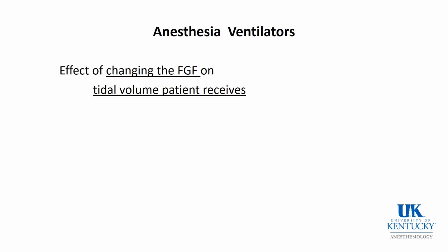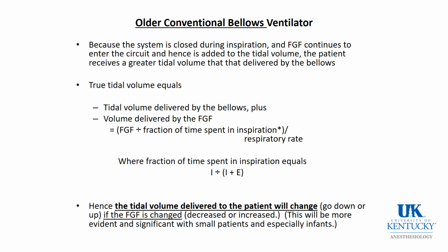Now, a minor comment, but it brings up a key word, is what happens when you change the fresh gas flow on the tidal volume that the patient receives from an anesthesia ventilator. In the old days, with anesthesia ventilators, during inspiration, the system was closed. That's the only way it would work.